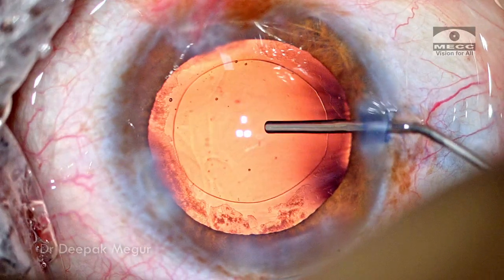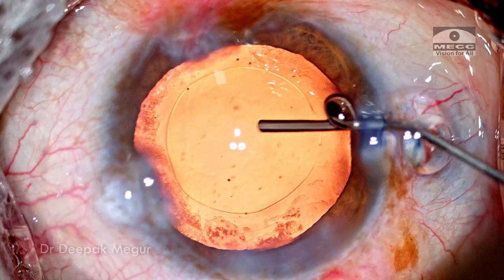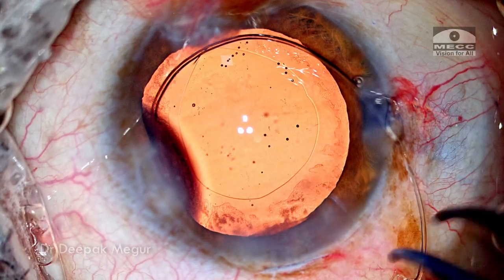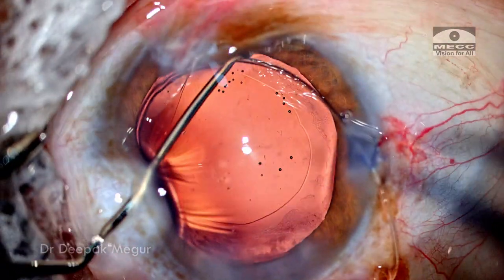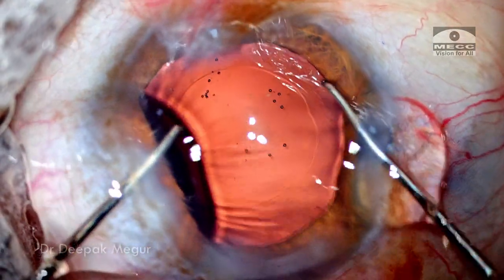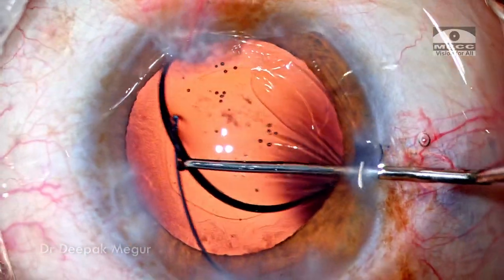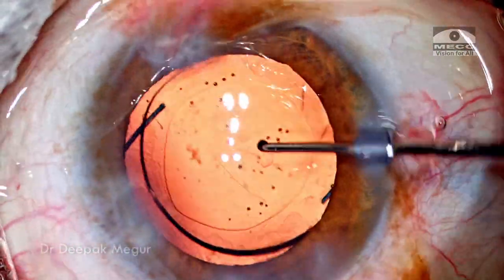Before putting in the lens I'm going to place a CTR. This is a quite large bag and being a pathological myopia case we expect the bag to be large. In these eyes I usually prefer to place a CTR — the larger version, an 11 to 13 mm sized CTR, is being introduced. The goal is to ensure equatorial stretch that pushes the posterior capsule up against the optic of the lens so it adheres well. In my experience this ensures better long-term centration of these lenses. This is required because the bag in these eyes is quite large, and most conventional lenses are designed for average-sized bags, so with a large bag I prefer to have a larger CTR in situ along with the lens.